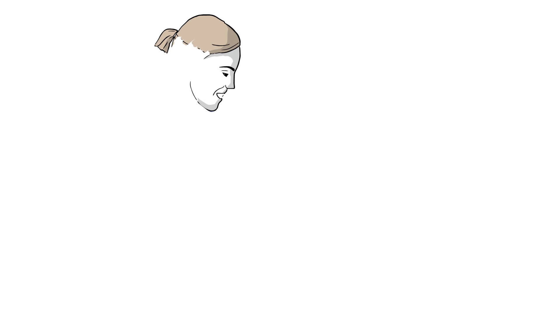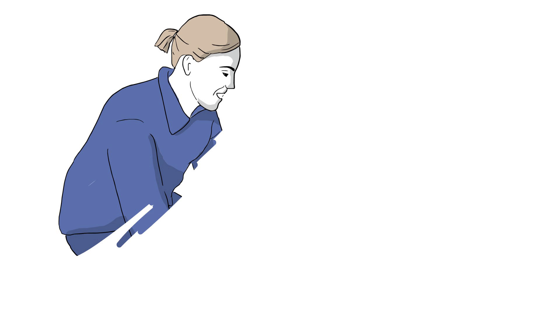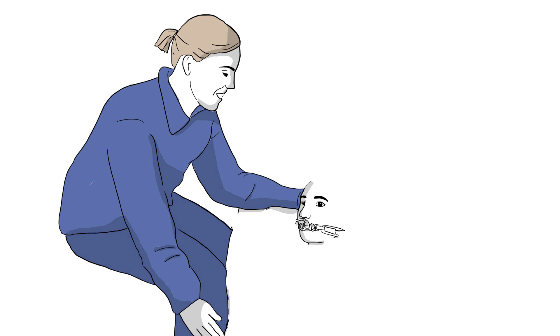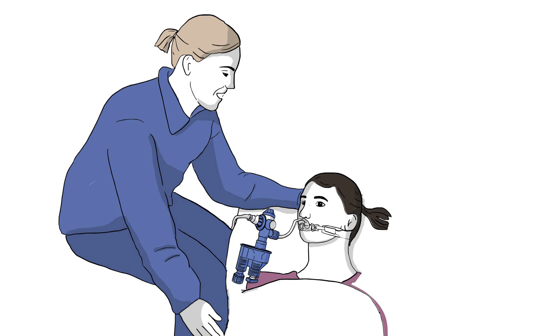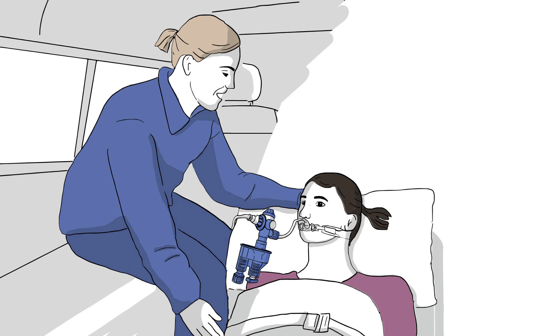The GoToVent is the perfect solution for these difficult situations, as it has been proven through studies that it can provide higher quality ventilation support than using a manual style resuscitator like a bag valve mask or BVM.